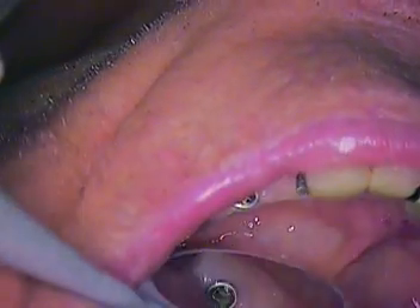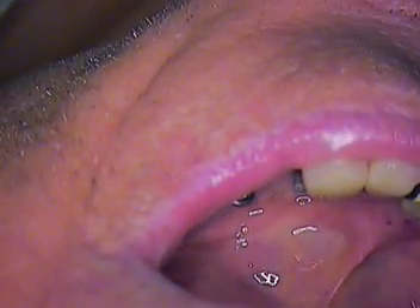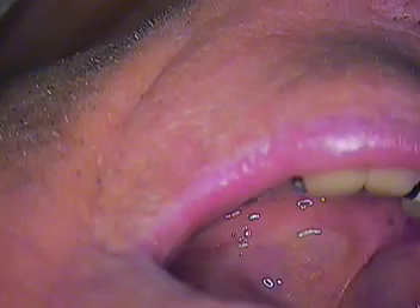It's good to look at this. It also tells us a little bit about where the... It's somewhere — it won't leave the floor, we'll find it. It's just going to give us an idea of what really did happen down in there, and maybe we could manufacture something. So we're going to rinse that out now with some cavity cleanser. Good news — we got that little piece of plastic out of there, so that was plaguing everybody.